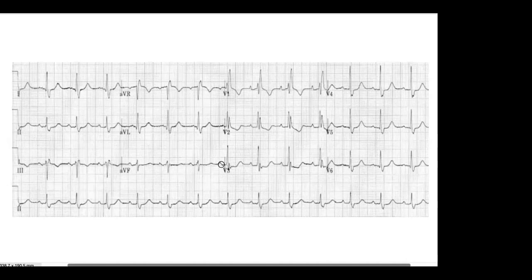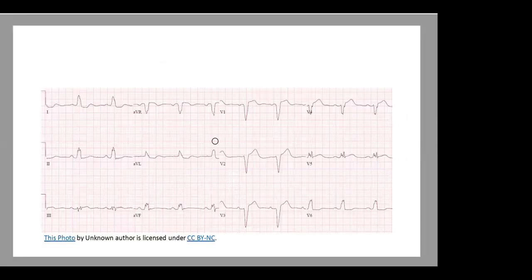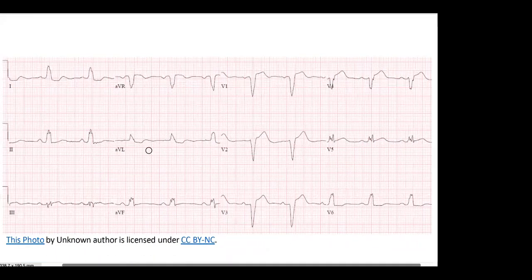Now we go back to the slides that we skipped. Just a minute.